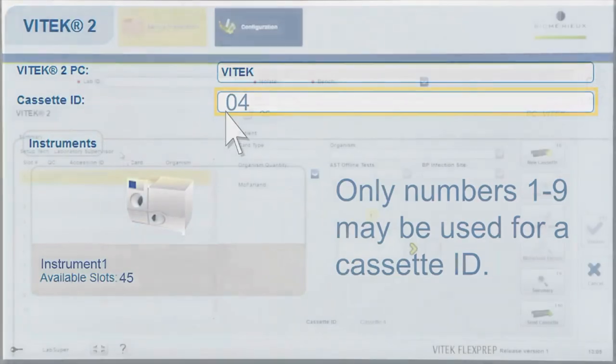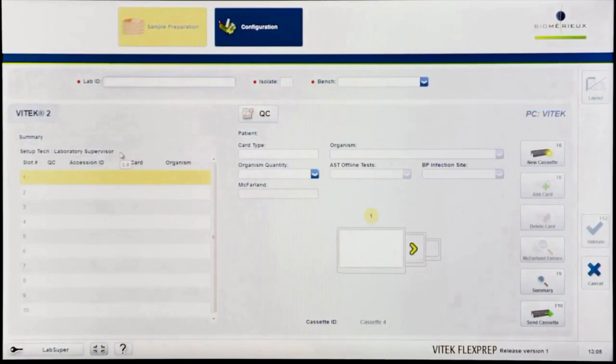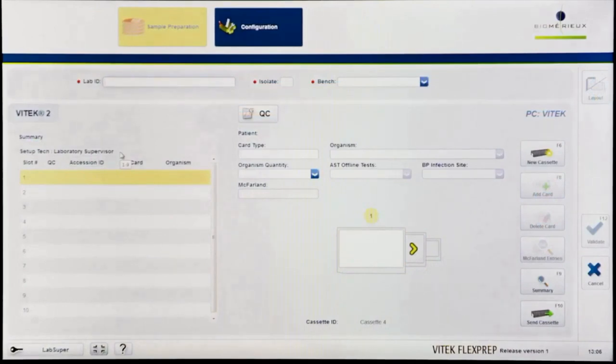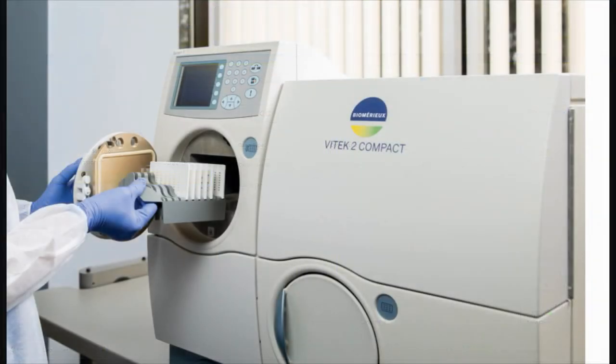There may only be one active FlexPrep cassette per cassette ID. If a FlexPrep cassette has already been defined utilizing the desired cassette ID, it must be loaded into the instrument before a new FlexPrep cassette can be defined with the same cassette ID.